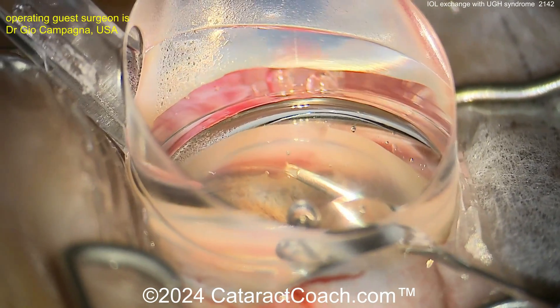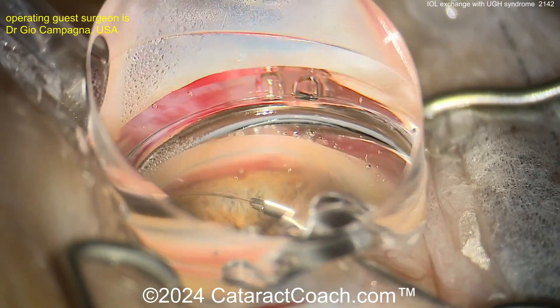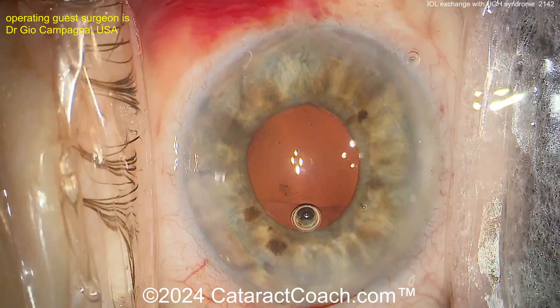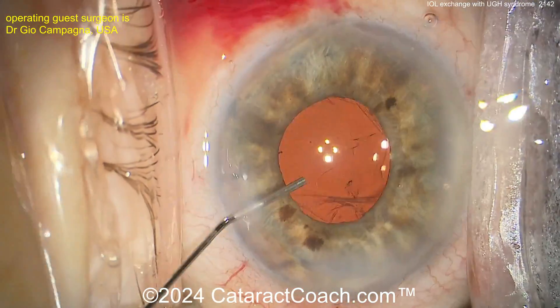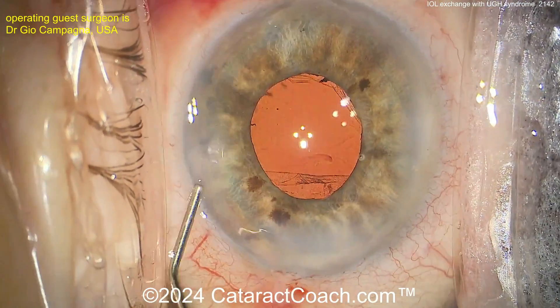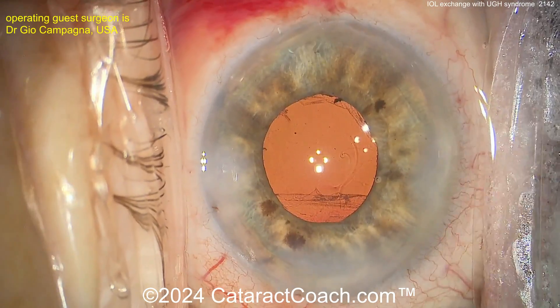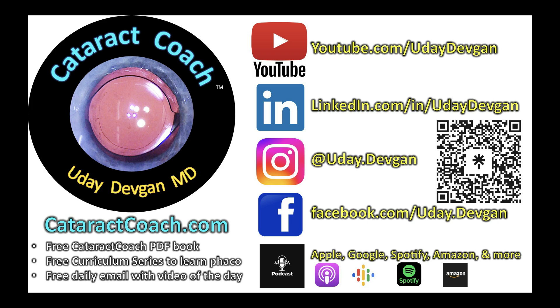But this could have all been prevented. You've got to avoid placing a single-piece acrylic lens in the sulcus — it does not belong there. It goes great in the capsular bag. For sulcus fixation in the USA, we don't have purpose-built sulcus IOLs, so we use a three-piece lens with thin haptics, hopefully with optic angulation and a rounded edge. Both acrylic and silicone IOL designs are available here that are appropriate for the ciliary sulcus. Patient had a nice outcome. Go to cataractcoach.com — read the curriculum on how to choose anterior vitrectomy settings. You'd hate to be in the OR having to look it up while your patient's sitting there with an open globe.